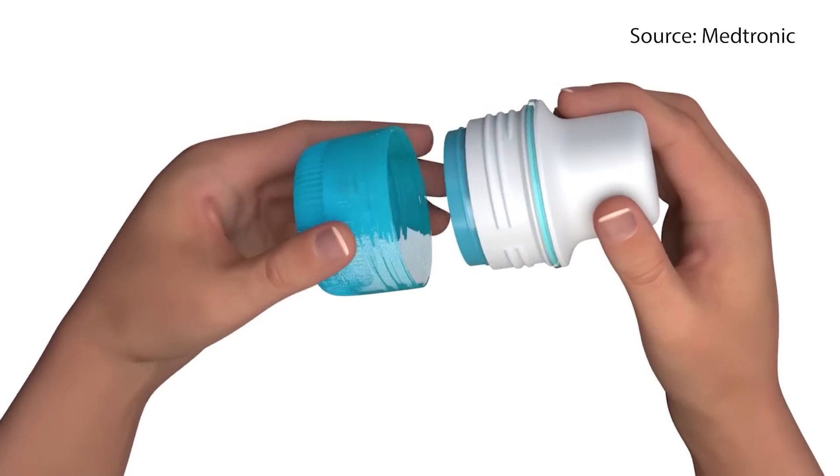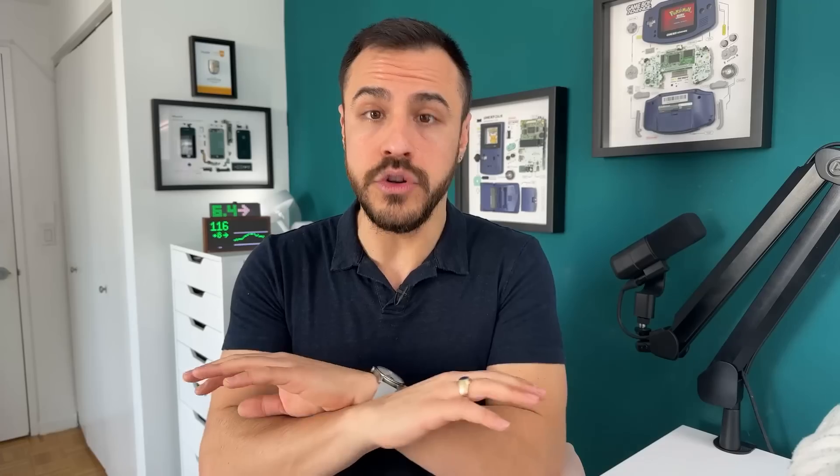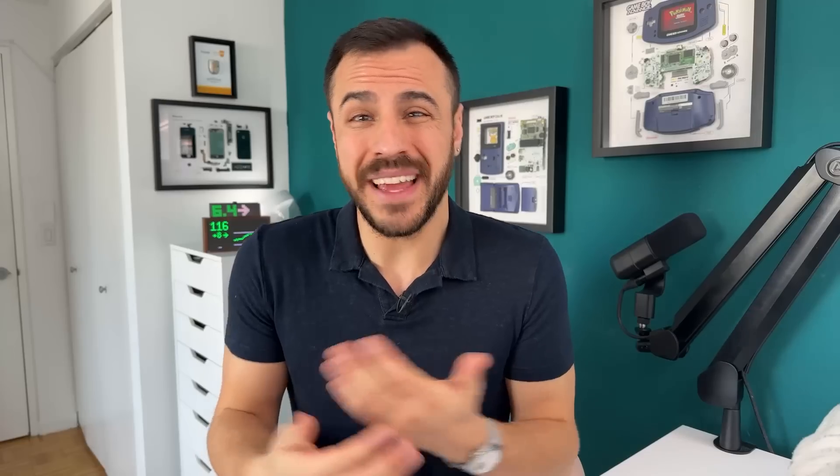Simplera has a two-hour warm-up, which is a bit unfortunate, especially compared to the competition — the Dexcom G7's 30-minute warm-up and the Freestyle Libre 2 and 3's 60-minute warm-up. However, you can overlay sensors and go with no time between sensors. This is off-label and not something Medtronic recommends, but Tom from Type 1 Talks tested it out and it works, so you can essentially achieve a zero warm-up time with these sensors.